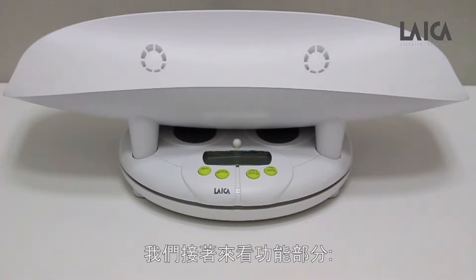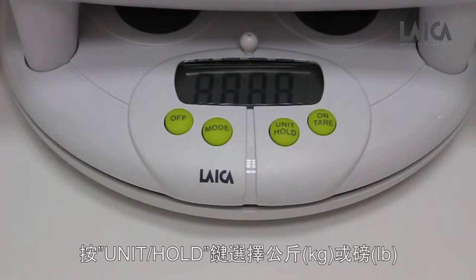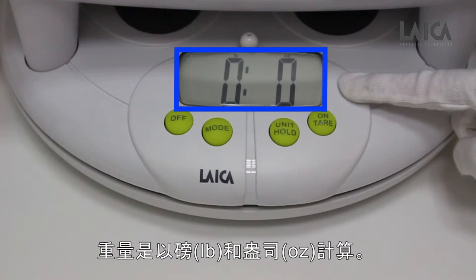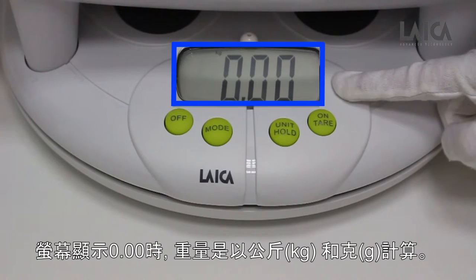Let's take a look at the functions. Turn the scale on with the on/tare key. Press the unit/hold key to select kilograms or pounds. If the display shows 0:0, the weight is measured in pounds and ounces. If the display shows 0.00, the weight is measured in kilograms and grams.